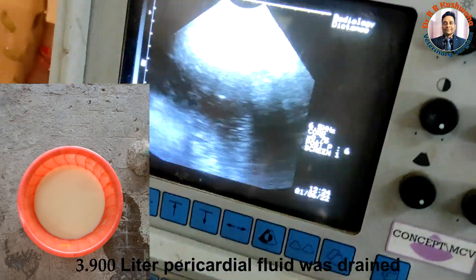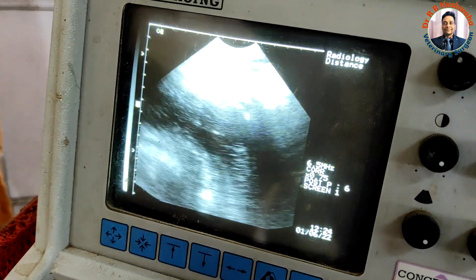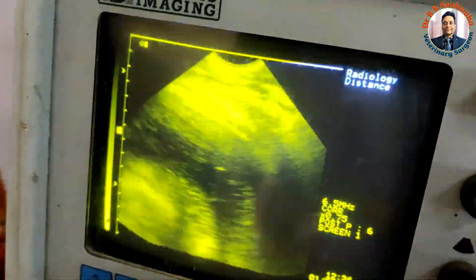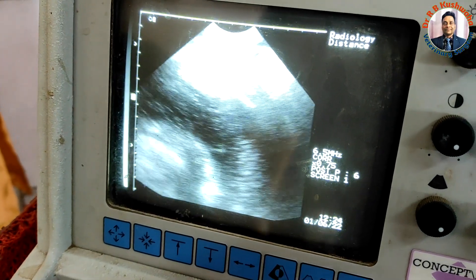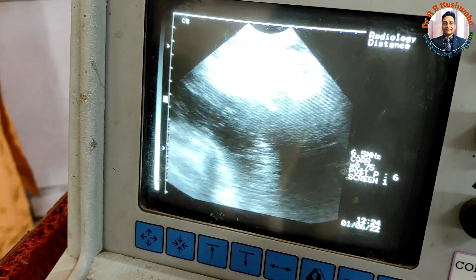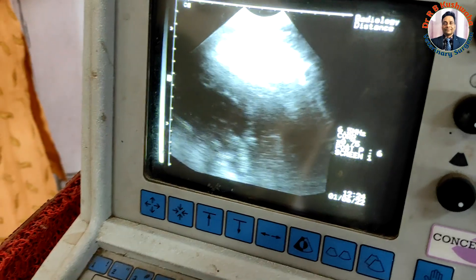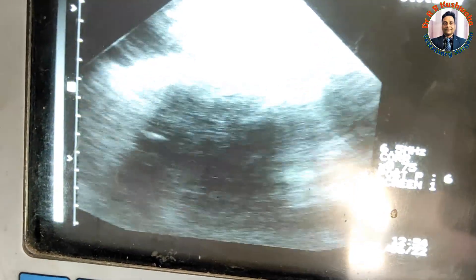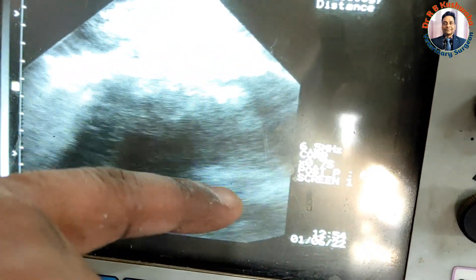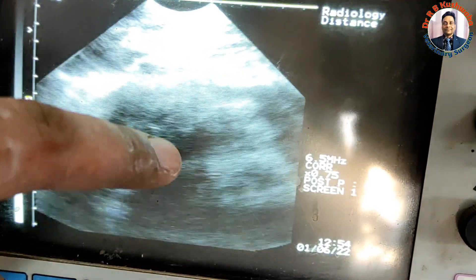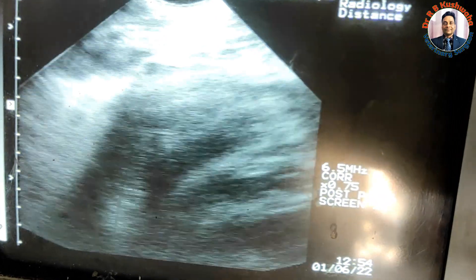Now we could see that after drainage of this much fluid, the level of fluid on ultrasonography has also decreased. Initially it was from here to here, now it is decreased. If you have the facility of ultrasonography then you can judge how much fluid is still present in the pericardial sac. Otherwise, it is better to drain completely until the last drop of pericardial fluid. We have now drained the pericardial fluid completely. You can see on ultrasonography this is the right ventricle — now it is contracting and relaxing in a better way, and the fluid column is almost gone, confirming complete drainage.